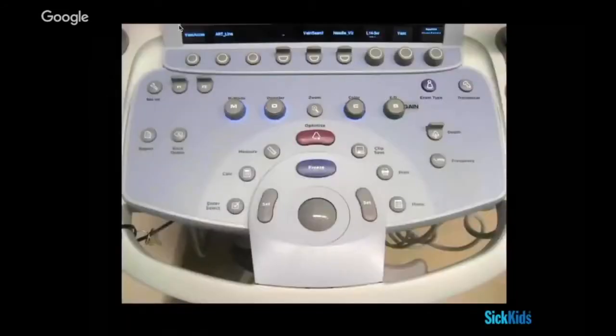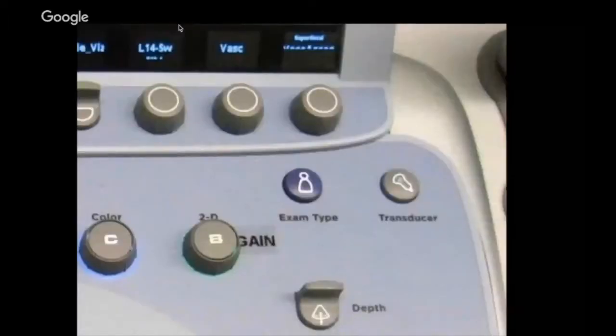Okay, so going back to the machine and trying to decide how I translate all of this stuff into machine operations. When you're driving a car, most of us are right-handed. So a lot of what you end up being asked to do in terms of operations of the car are things with your right hand, right? You're going to reach here to do important stuff, like indicate which way you're going, like operate gears, put the car in reverse, that kind of thing. And so it's the same on the machine. The most commonly used stuff is kind of top right.